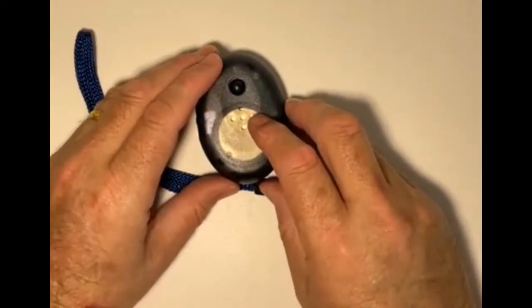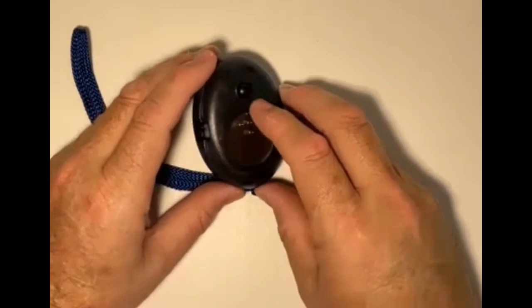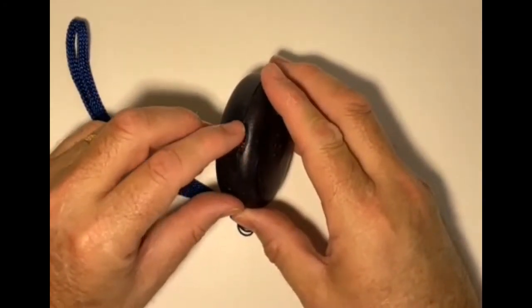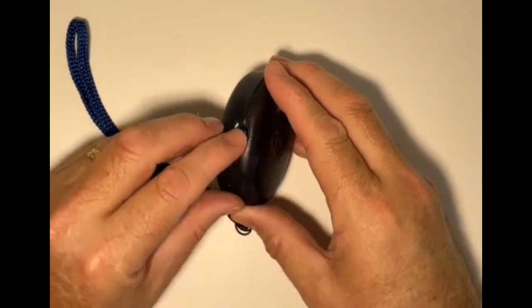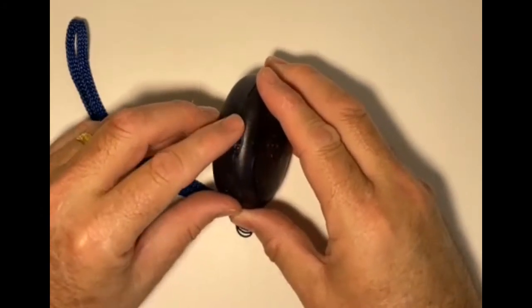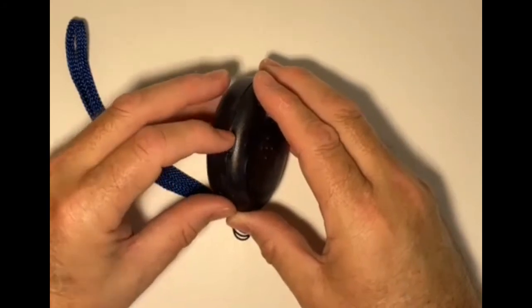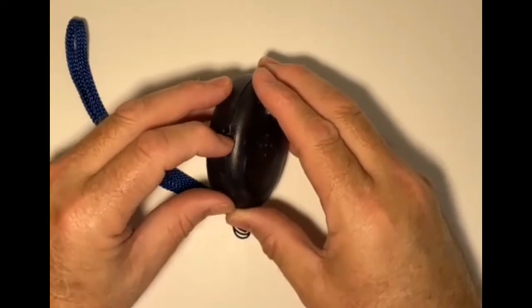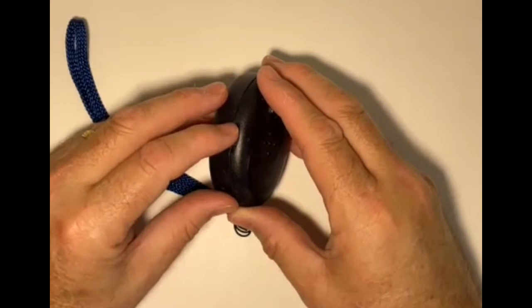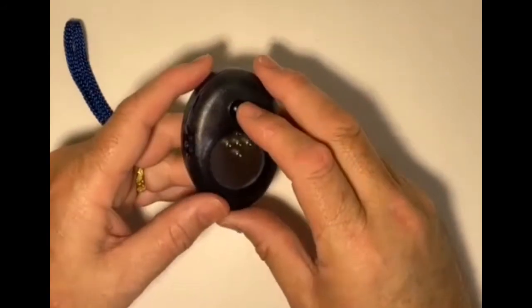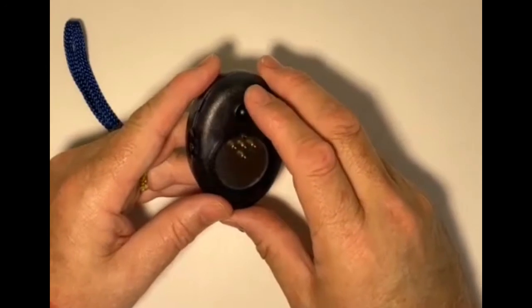The way this compass works is on the side here we've got a slide button. If I push it away from me to the furthest position, that's the English setting. If I push it back towards me to the middle setting, that means it's currently off. If I try and press the top button, nothing's going to happen.